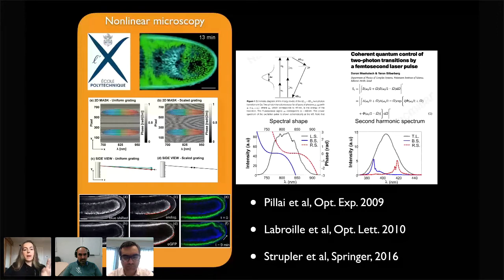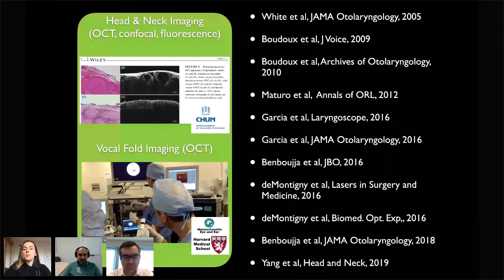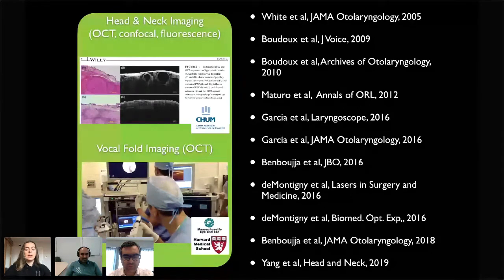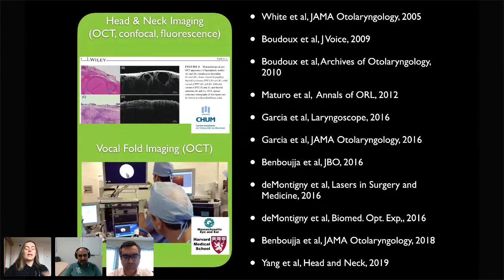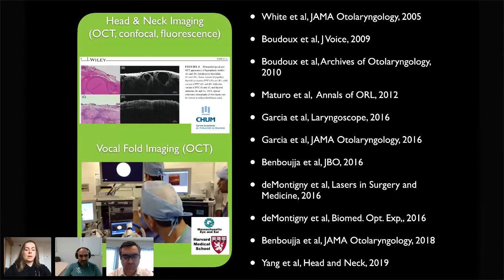So this is one axis of my lab, just broadly speaking, but we also work on technology that is a little more mature and goes to the clinic. This is Dr. Hartnick at Mass Eye and Ear, and you see Fouzine Bouja, my first PhD student, who is testing his OCT system in the clinic. It's a system that he built entirely to be able to look at different areas. Some of my students are working in Montreal on thyroid and parathyroid, but with Dr. Hartnick, we're looking at vocal folds. So everything essentially head and neck. These are activities that we carry through.